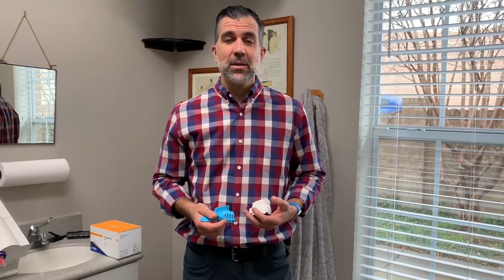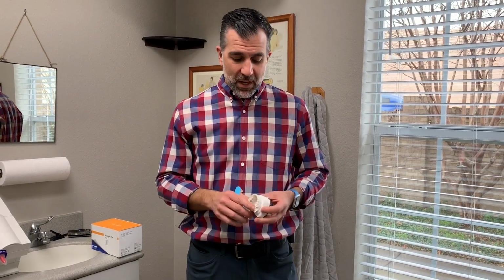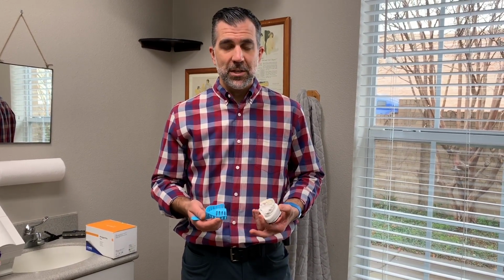Dr. Chad Duplantis from Fort Worth, Texas, and today we're going to talk about fabricating a putty matrix to be used for our longer span provisionalization of our aesthetic cases. On this case, we have a wax up from our laboratory that's teeth 5 through 12, and we're going to be fabricating veneers on this patient.